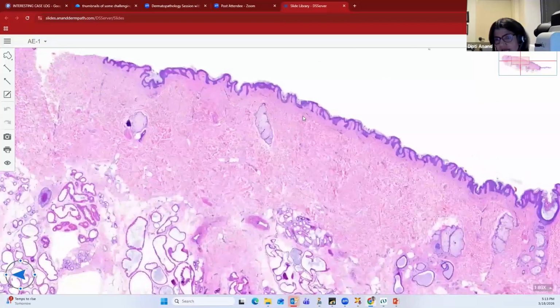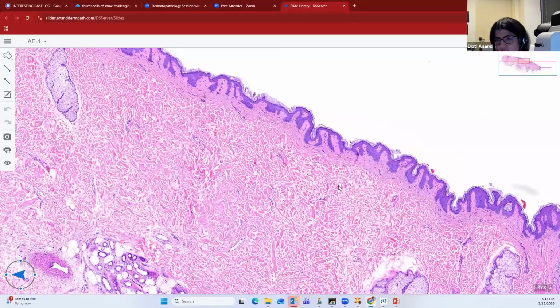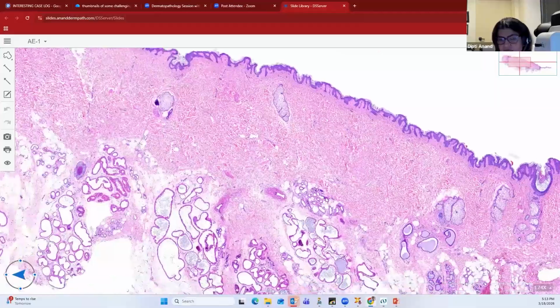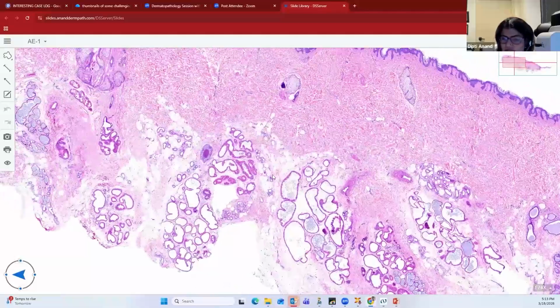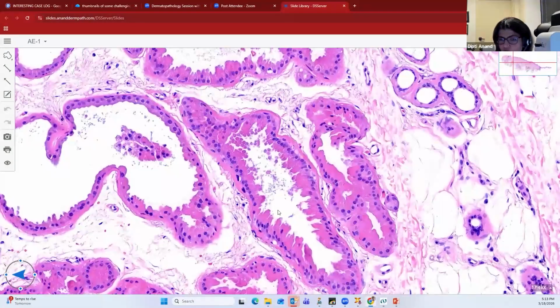The epidermis in normal axilla is often papillomatous. So you can see this undulating epithelium that's common for any intertriginous epithelium. And deep down in the dermis and the fat, you see continuous apocrine glands. So first of all, learn how to recognize apocrine glands. How do apocrine glands look? Apocrine glands will have abundant, voluminous pink cytoplasm of the lining epithelium.